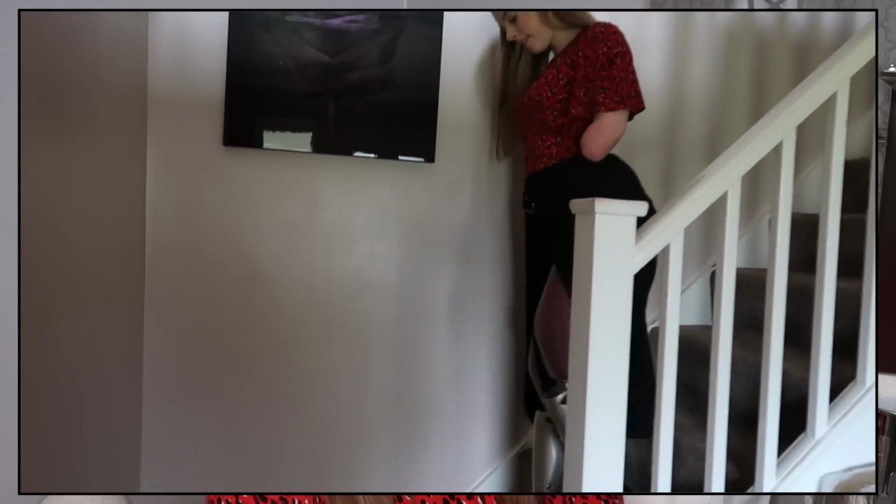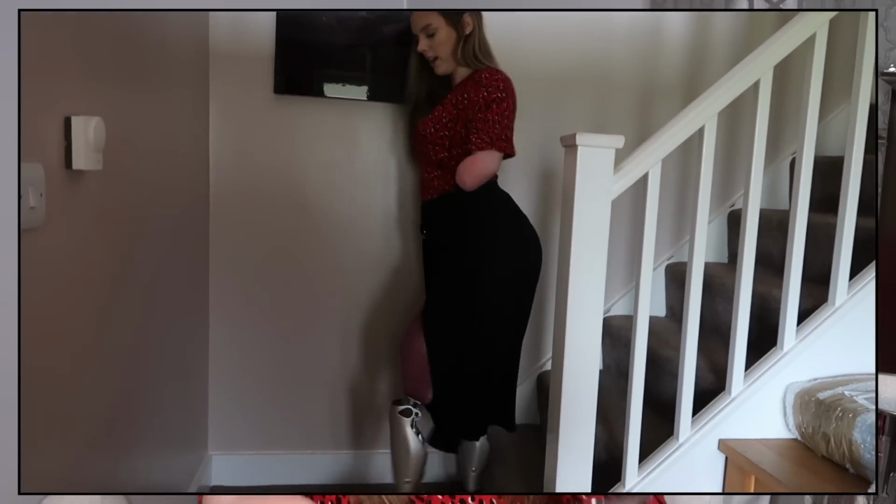And they suggested following the back of the step that I was going to, you'll see in the video, with the foot that is about to land. So I'm keeping back to the step to follow myself down to land. I feel like I'm making it really overcomplicated, but I can't think of a better way to describe it. You'll watch it in the video. This just meant that I had so much more control and I felt so much safer, and this really worked. I think we were all a bit like, oh my god. And so yeah, that student physio had some really good ideas.